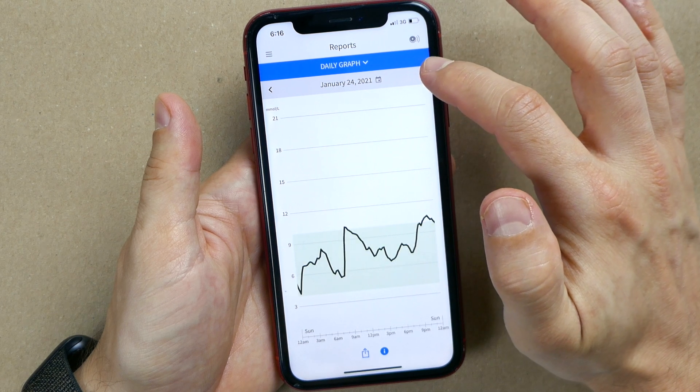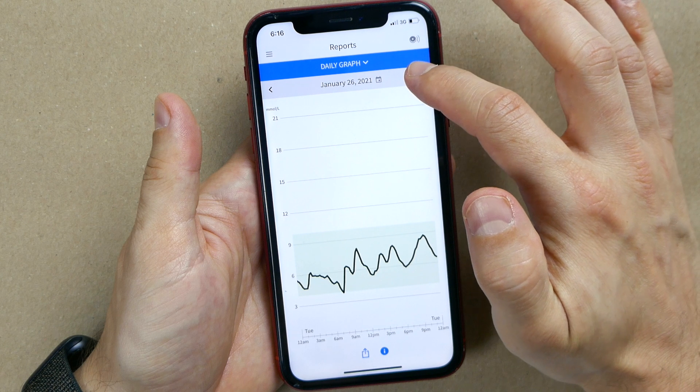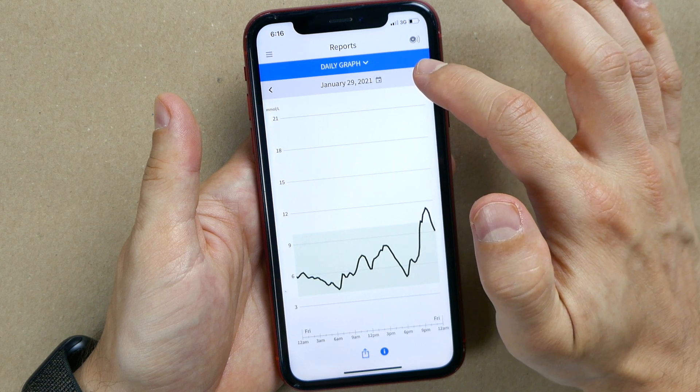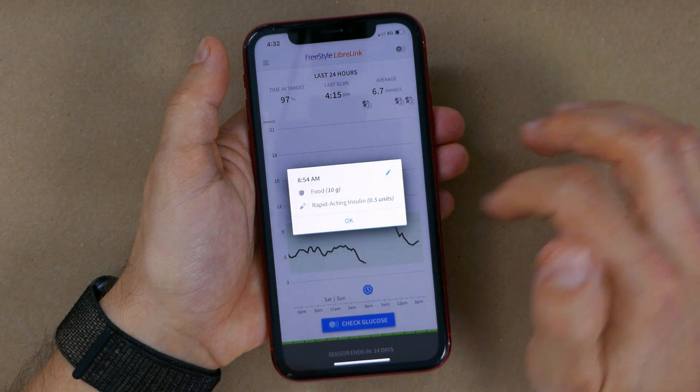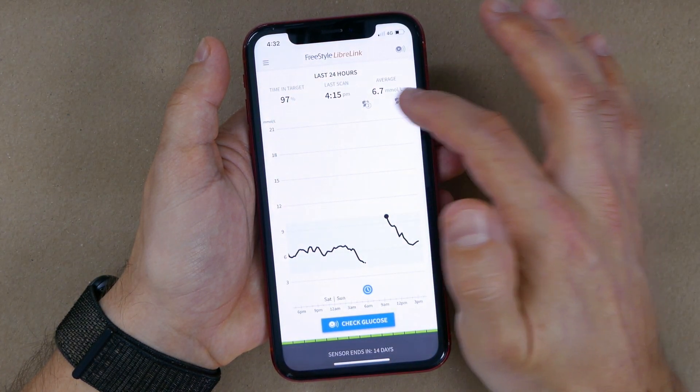Next is daily graph, where you really see how your blood sugars have been trending day by day. You can scroll through the last 90 days and see not only blood sugar values but also all the notes you added in the logbook, helping you understand how the meals you eat, activity you do, and insulin you take impact your blood sugar. I encourage you to pay attention to this, because learning from this information will really take your diabetes management to the next level. Studying these trends helped me identify what's causing my spikes and drops and reduce or eliminate them.